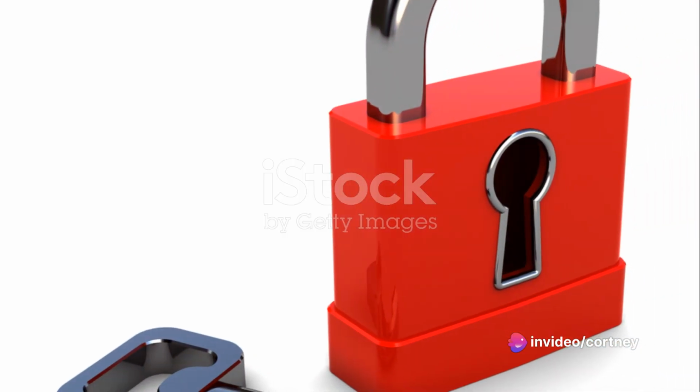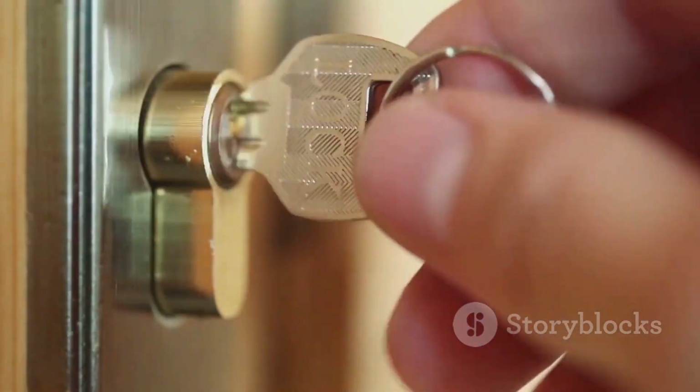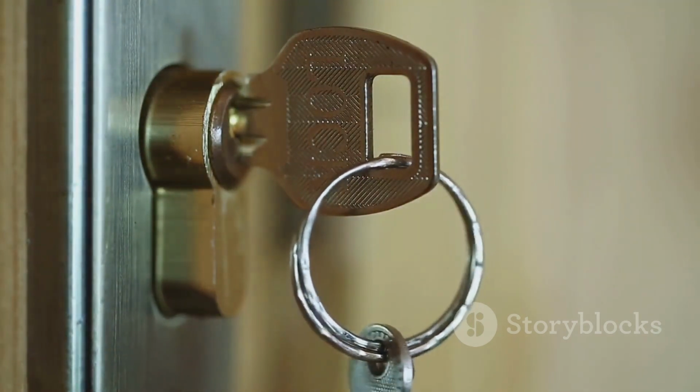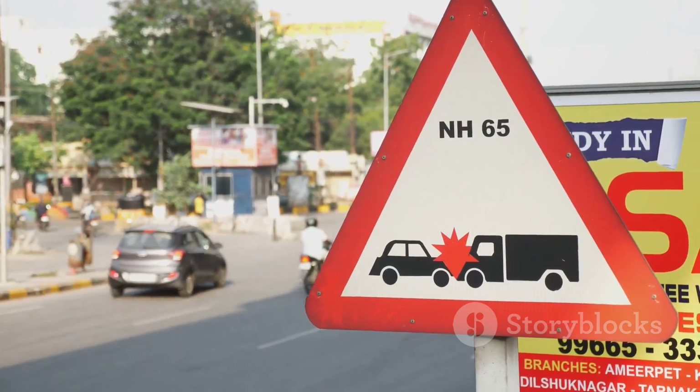Antibodies can be made to find almost any substance within a body. It works like a lock and key mechanism, where the drug or its metabolite acts as the key, and the antibody is the lock. When the key fits perfectly into the lock, it signals the presence of the drug, resulting in a positive result. We usually call this a non-negative because technically it's not truly positive, yet it's important to note that this is a preliminary test.